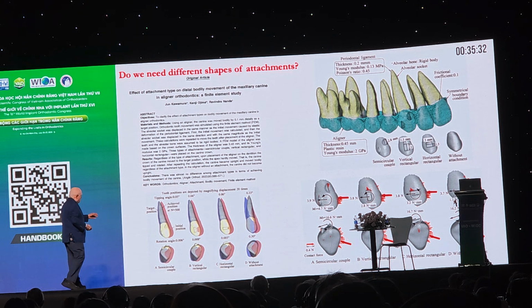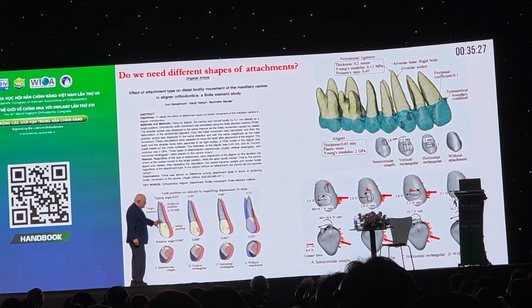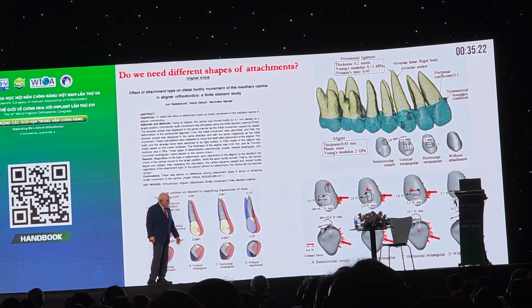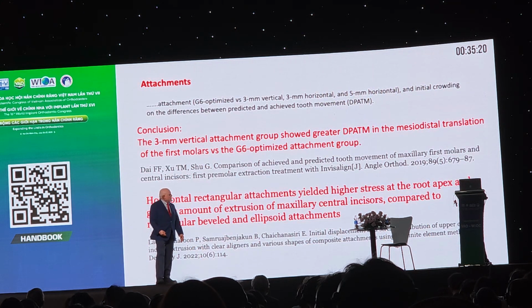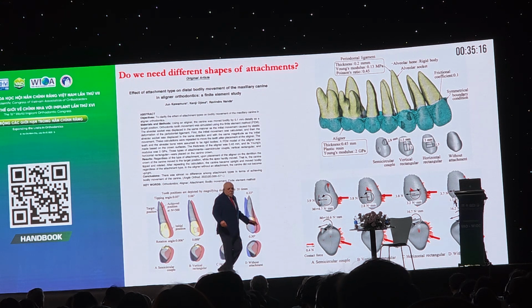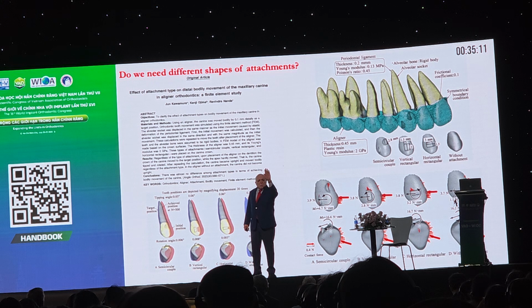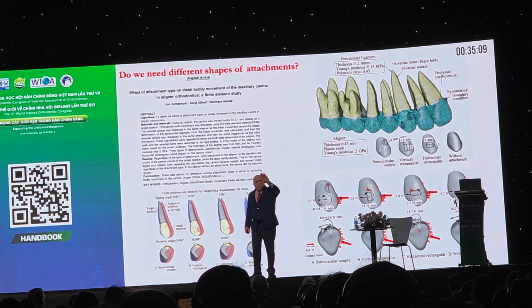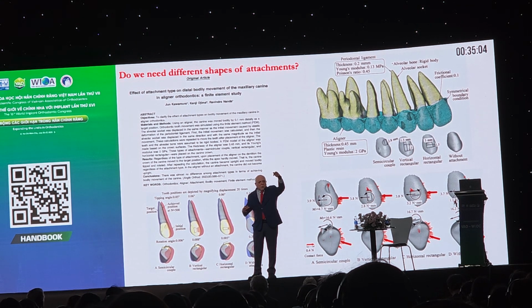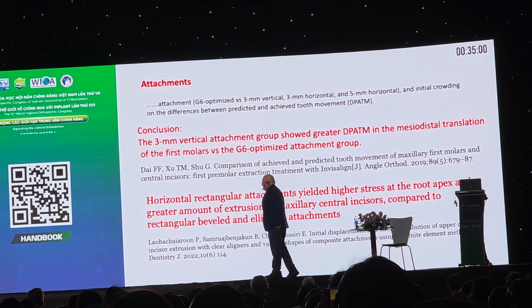But what we found out was that if you use this type of attachment proposed by Invisalign, or you use this type of attachment, there is no difference, none whatsoever, in the type of tooth movement you are going to get. Same. I can take my attachment, I can angulate it anywhere, clockwise, counterclockwise, apply force from top, bottom, anywhere. Same force system. So, attachments.